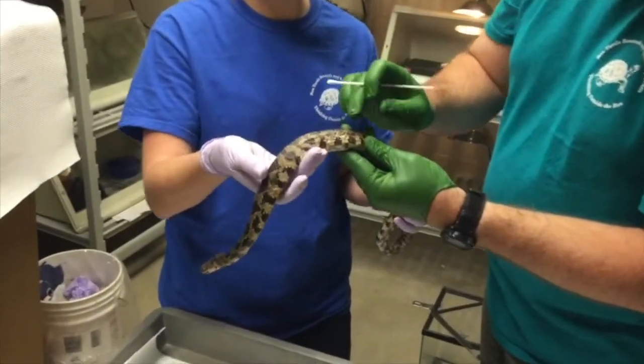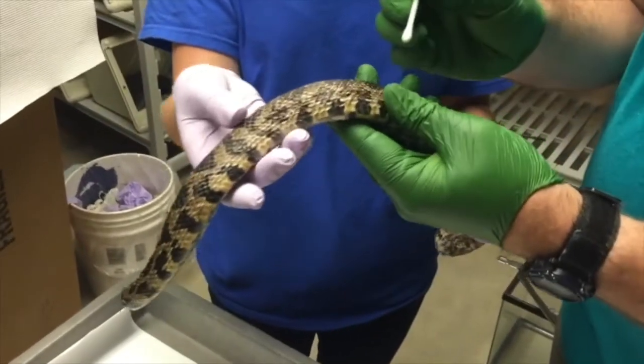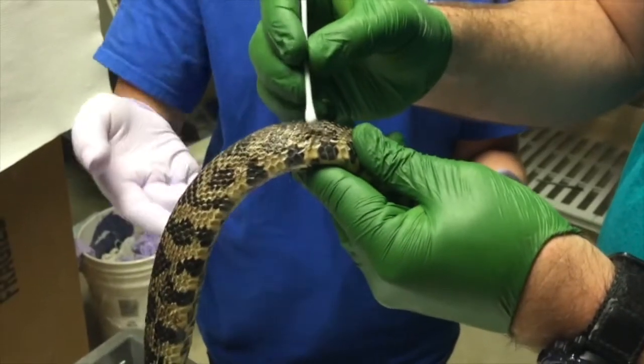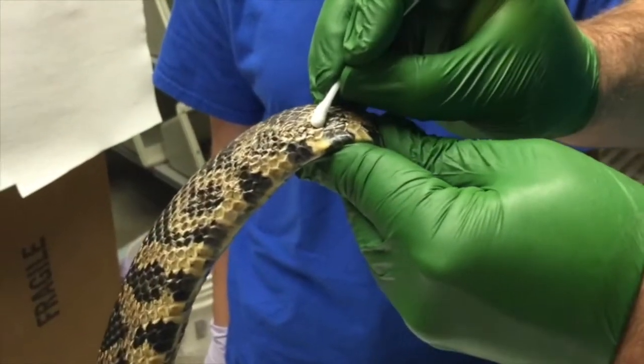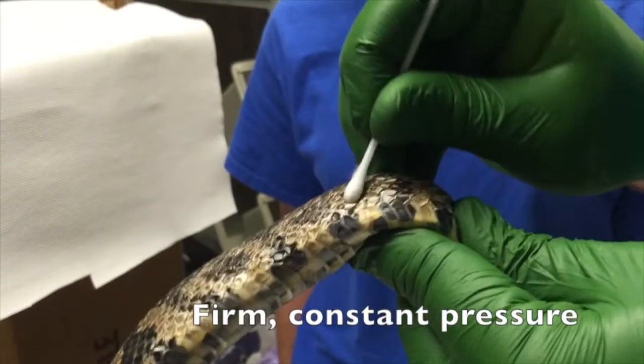For snakes with lesions, a swab will be taken from each lesion in addition to the 2 body swabs. Just use a separate clean cotton tip applicator and only swab the site of the lesion. If any scales or scabs are removed during swabbing, include these with the swab in the provided Eppendorf tube.